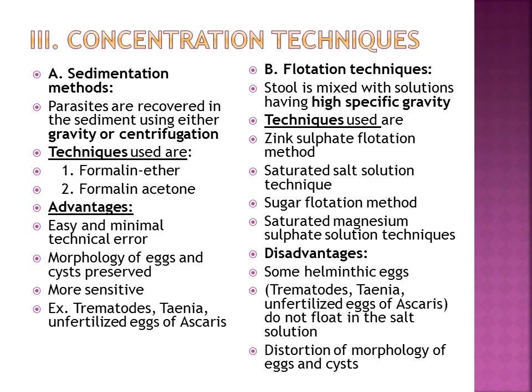In the flotation techniques, stool is mixed with a solution having high specific gravity, and the techniques used are saturated salt solution, zinc sulfate flotation method, sugar flotation method, or saturated magnesium sulfate solution techniques. The disadvantages: some helminth eggs like trematodes, taenia, and unfertilized eggs of Ascaris do not float in the salt solution, and then distortion of morphology of the eggs and cysts is also there.